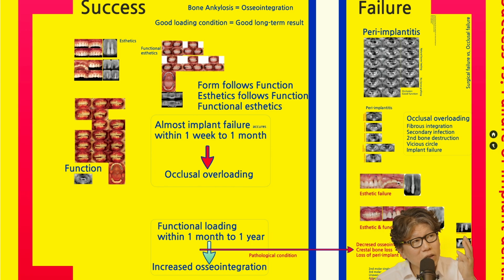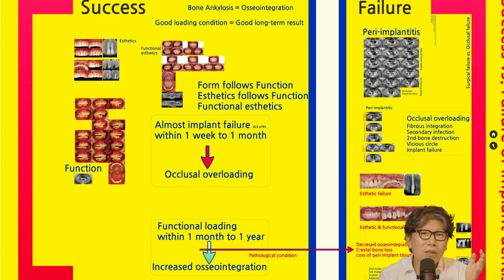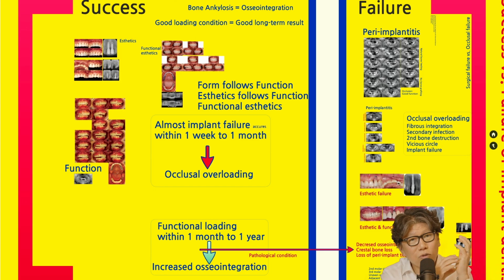You place the implant in a good location, in a good orientation. Then you have a good occlusal protocol. Then you have a solid abutment connection, a connection that doesn't have micromobility. Macro design is important. And then the surface, a clean surface anyway. And then maybe SLA or SLA nanosurface is a little bit of an advantage. I think it's this concept. Other than that, there's nothing special actually.